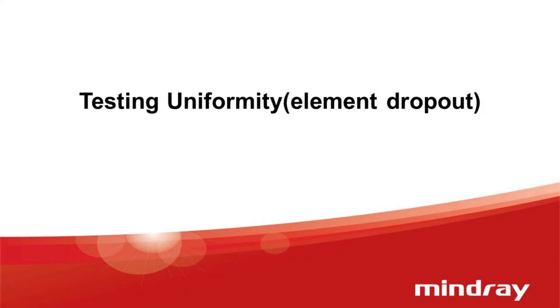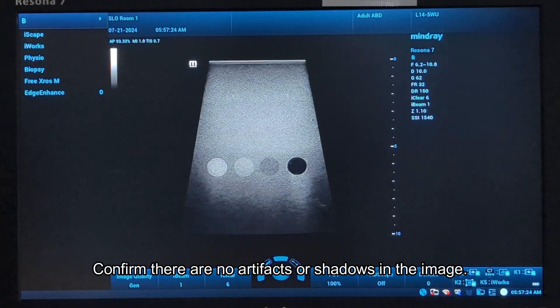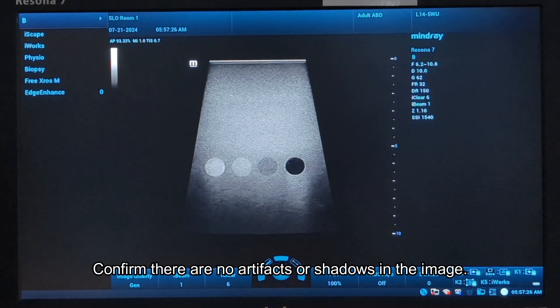Testing uniformity: element dropout. Confirm there are no artifacts or shadows in the image.